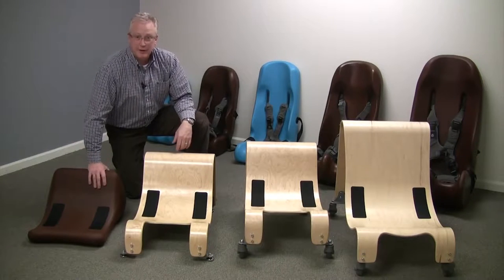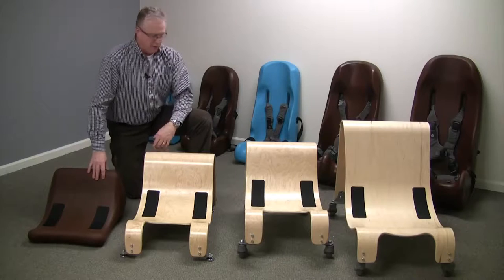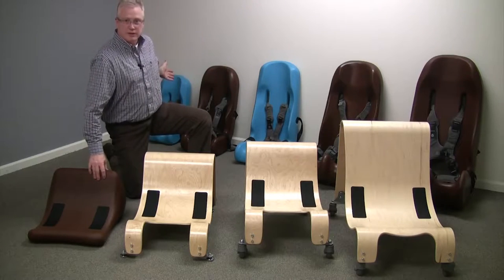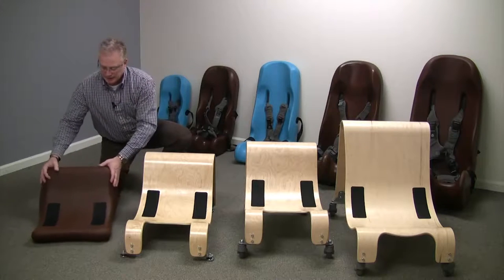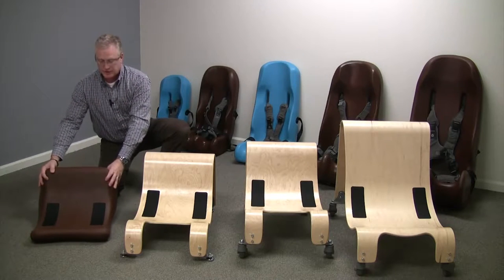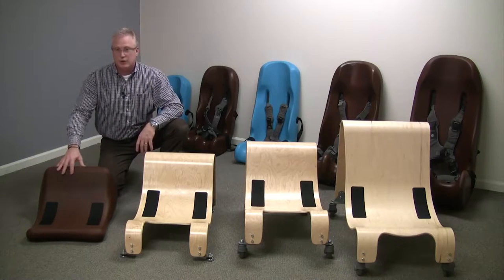Hi, I'm Steve from Special Tomato, and I'd like to share with you the differences between our bases for our soft touch sitters that you see right here behind me. First I'd like to explain that this is our soft touch sitter floor base, which takes sizes one, two, and three.